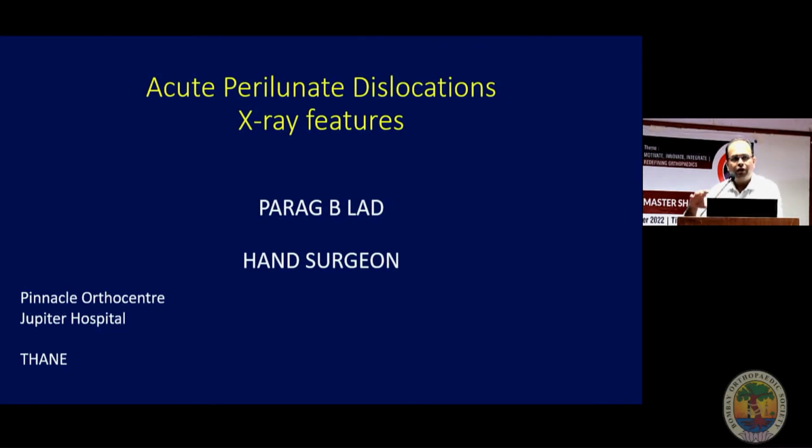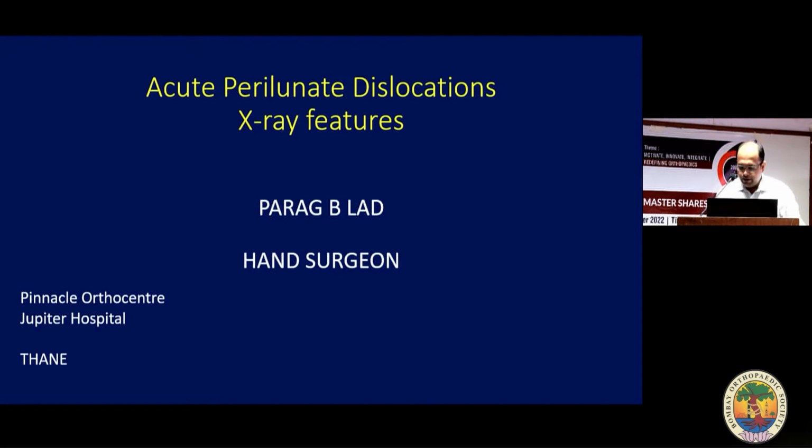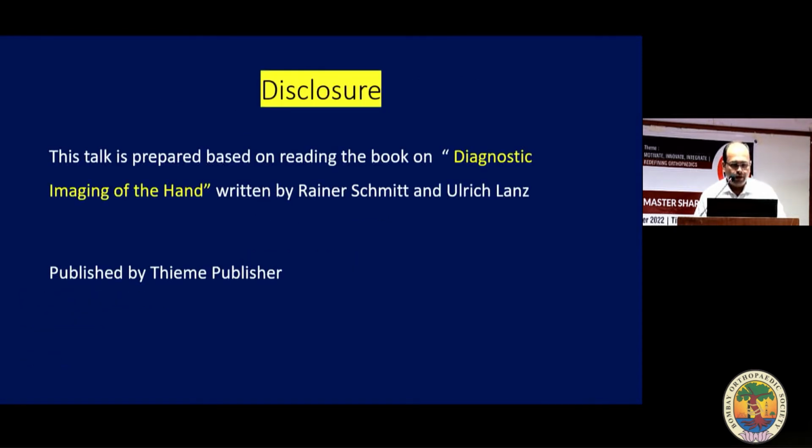Now another important session on the wrist is going to start. I am Parag. If we can't diagnose, we can't proceed for the treatment. We all practitioners know that. Let us understand what X-ray usually tells us about perilunate dislocation.